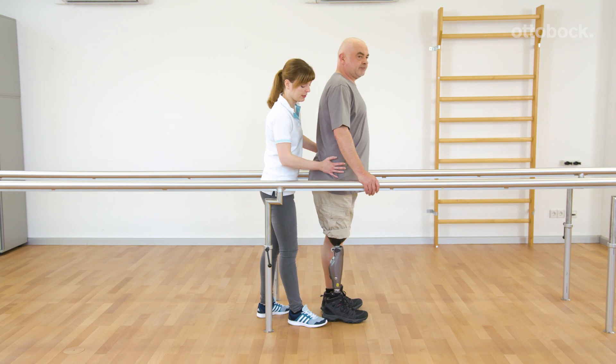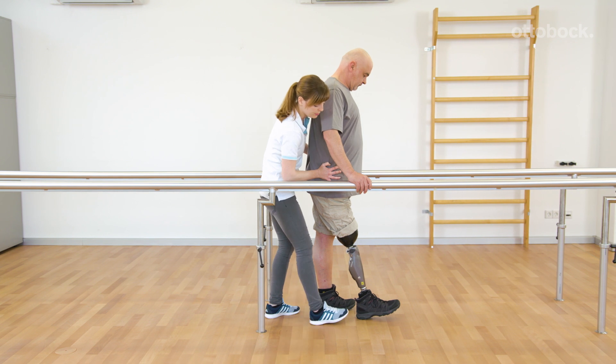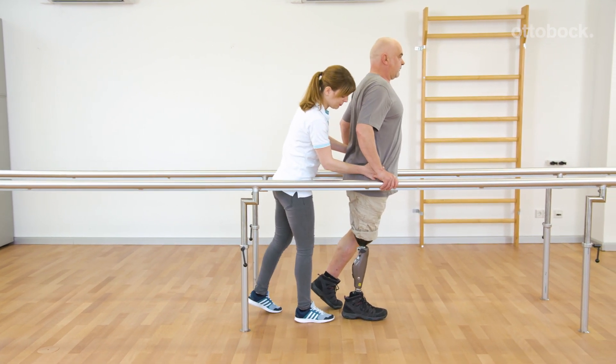Franziska guides the pelvis during the weight shift onto the prosthesis. The trunk and the pelvis simultaneously move forward. A hyperlordosis should be avoided.